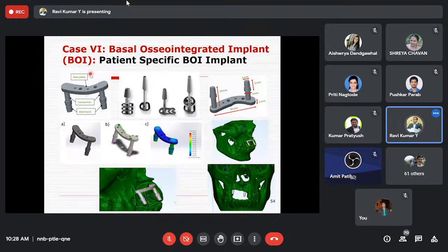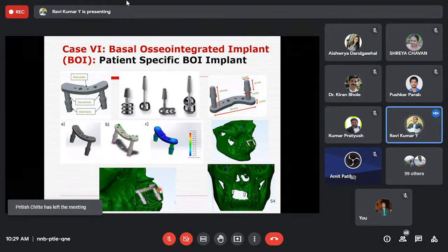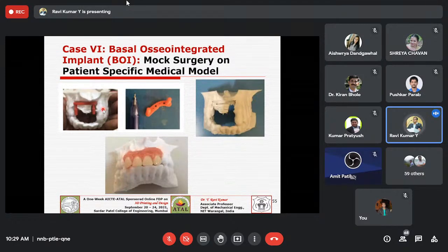That's where additive or 3D printing is attractive, for designing and fabricating a patient-specific or patient-matched implant. Based on the fracture, we designed this implant, which you can see is not symmetric. Why? Because it should match the nature of the fracture he suffered. We need to check the implant for failure under applied loads and for fitment. For fitting, you have the CT data of the patient and the designed implant, and you check how it is getting fitted before you go to the actual surgery.